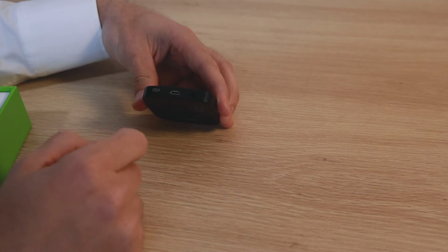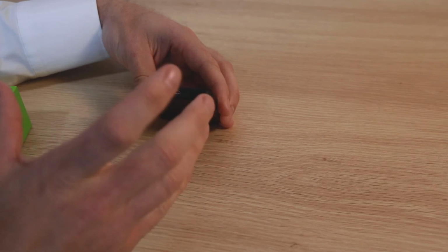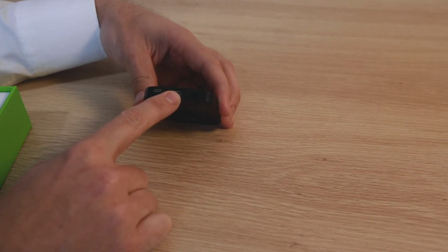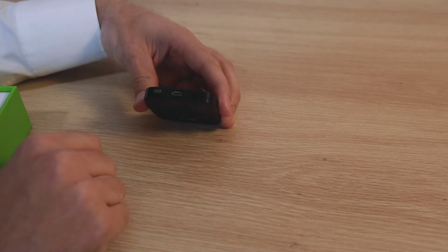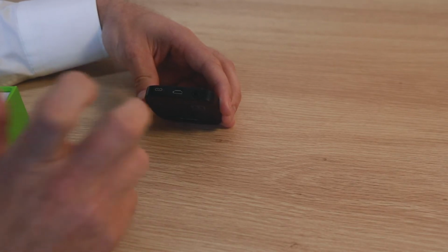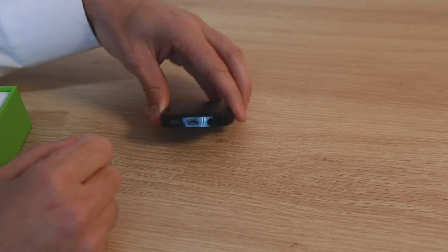The hearing aids themselves, you need to turn them off and on, and that puts them in a pairing mode for approximately 3 minutes. To connect the TV connector to your hearing aids at the very start, you just press this button here, and that will put it into a pairing mode, and you'll hear a signal through your hearing aids that will tell you when it's connected.